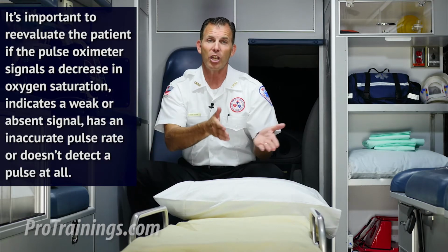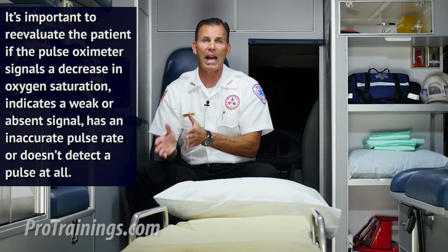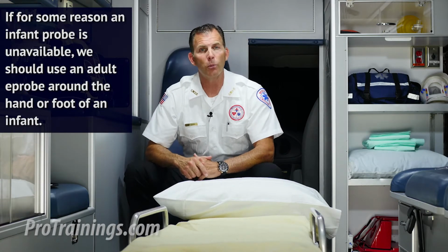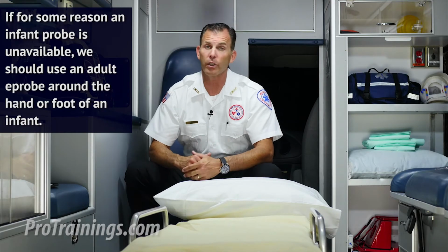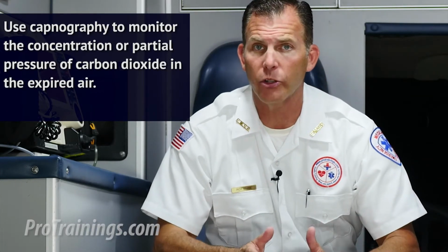Don't imagine that it's just a failure of the pulse ox. It actually could be a true monitoring of a change in the condition of our patient. Now, it's important that if we see that failing pulse oximeter, that we reevaluate the child and determine if the patient is stable or if they need additional care. If for some reason an infant probe is unavailable, we can use an adult probe around the hand or the foot of an infant.